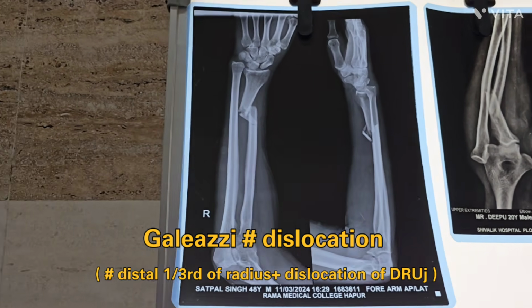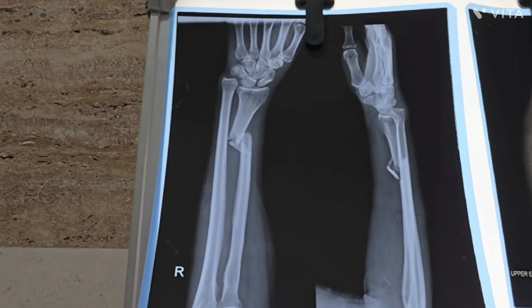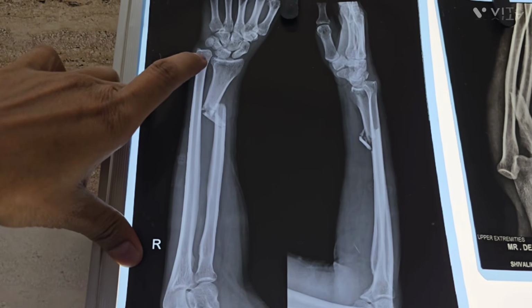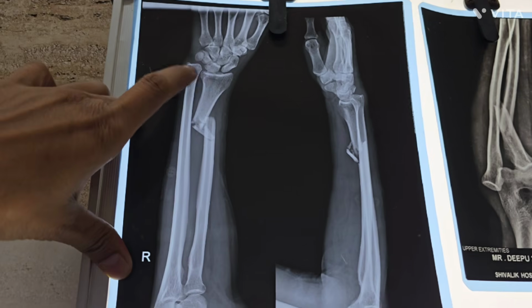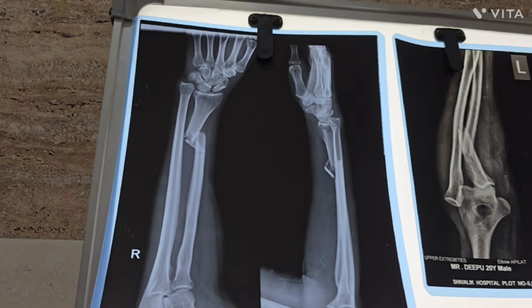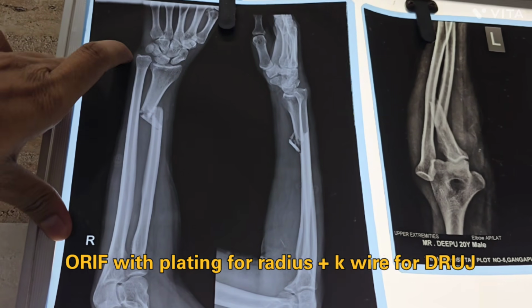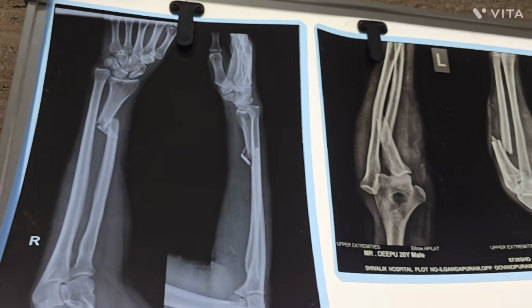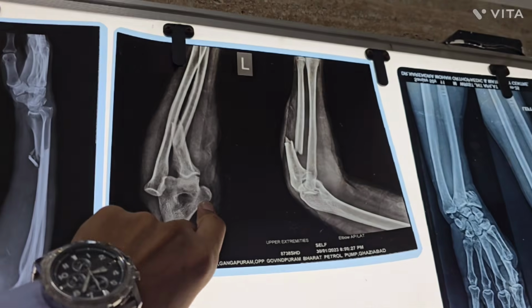Why is it a Galeazzi fracture? In Galeazzi fracture dislocation, there is a distal 1/3 radius fracture and DRUJ, distal radioulnar joint, dislocation. This one is dislocated. This ulna is distally migrated. So in this, what will you do? Open reduction, internal fixation with plating, and reduction of the distal radioulnar joint with K-wire. So this one is Galeazzi and this one is Monteggia fracture.